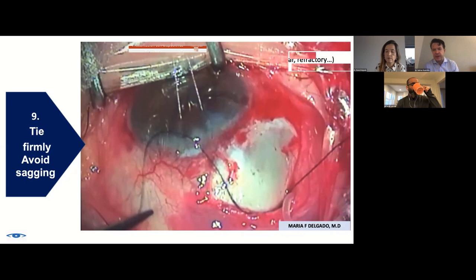That can be good and help keep a tube back, or it can put force to push it forward more. It just depends on how shallow that patient's orbit is. So I keep that in mind, but for me, it's probably 10 millimeters. The downside of my technique is sometimes I can't find the plate postoperatively because it's really a retrobulbar Ahmed valve. If you can conceive of such a thing, it's not so much a tube anchored to the sclera.